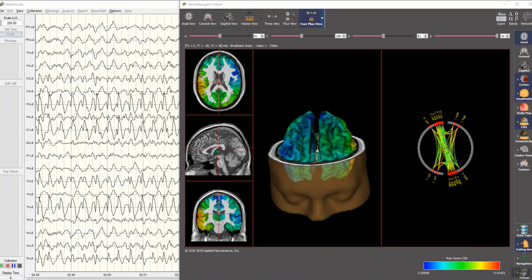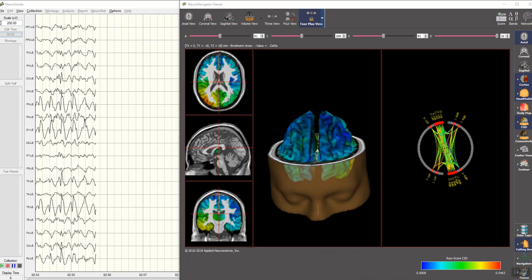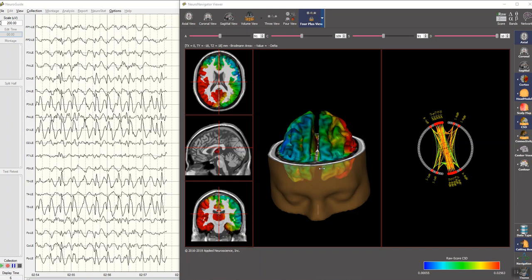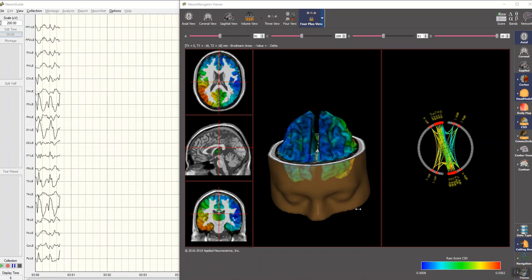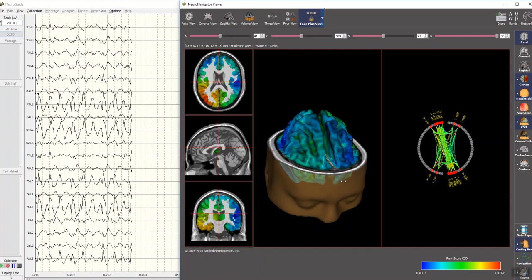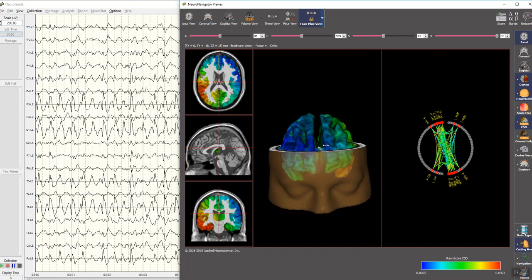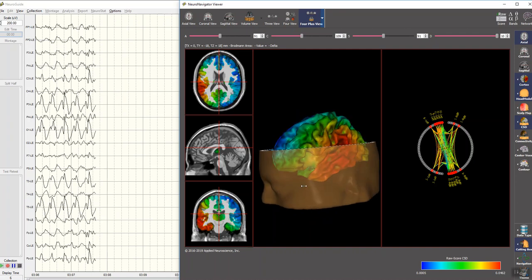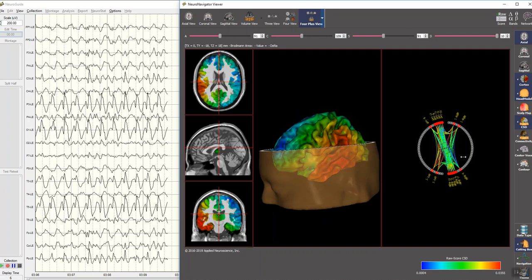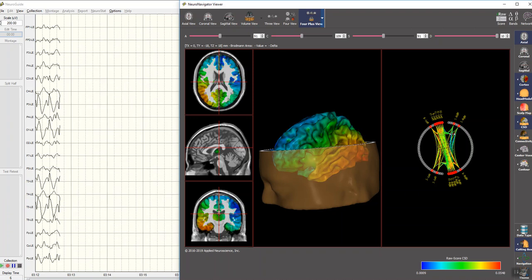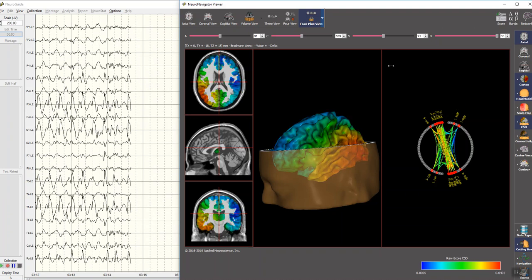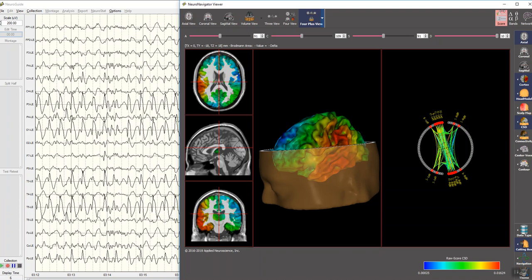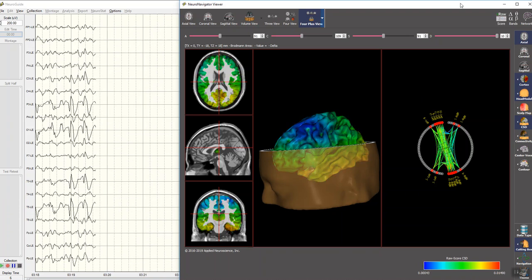This is a video of the new connectome addition to the Neuronavigator here in the right panel. The regular cortical rendering with the transparent head is on the left, but now we have a connectivity map based upon the connectome which we can change both for raw scores or z-scores with this control up here on the right.